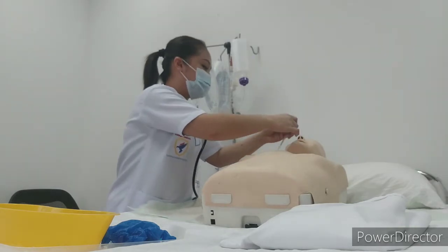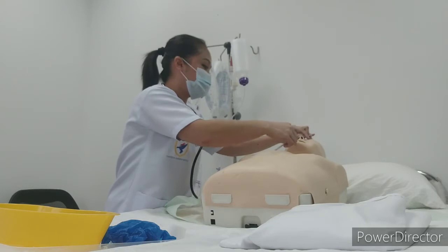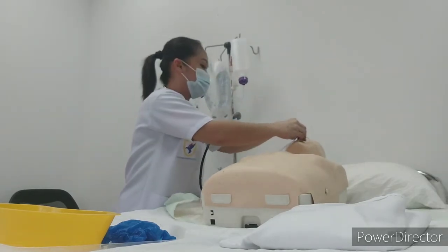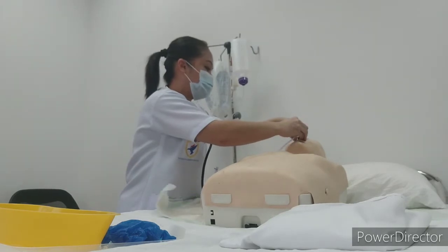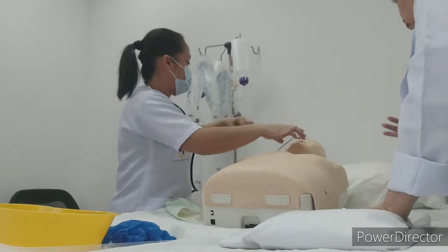So we will put a plaster on it. If it's okay now, it's inside, so we will put a plaster. The first one, this one. Okay. Relax.